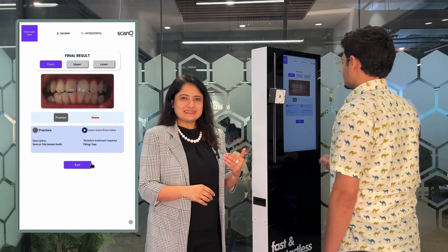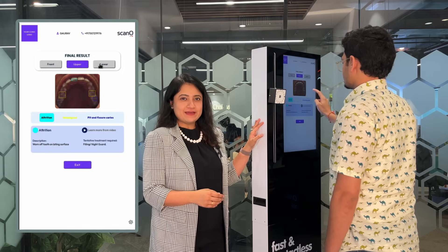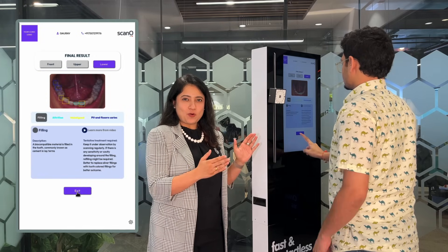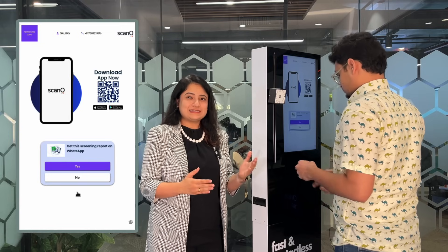All these findings, as they are visible on Scano Air, the patient gets the same report in a PDF format on his WhatsApp.